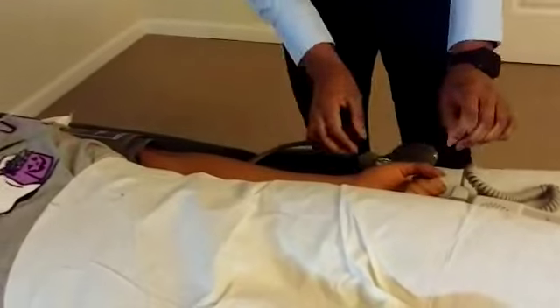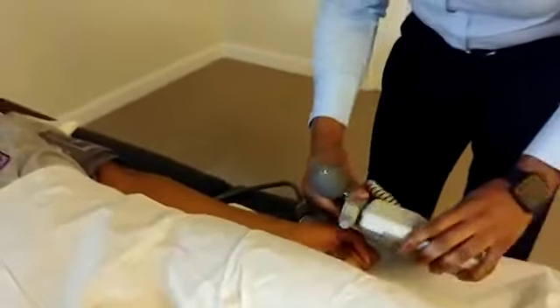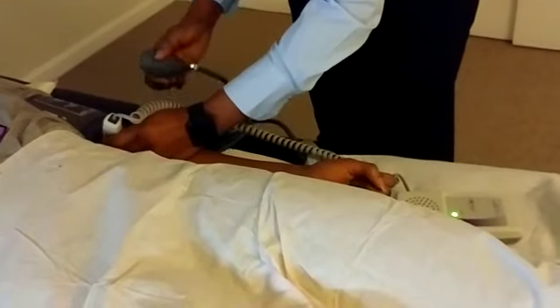So today I have a young lady here. We're going to start with, for the sake of time, just the left arm pressure, and I'm going to do the same thing with her left ankle. So you wrap the cuff on the arm, and I have my continuous wave Doppler here. I'm going to start with a brachial pressure.